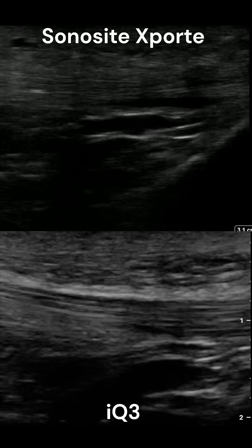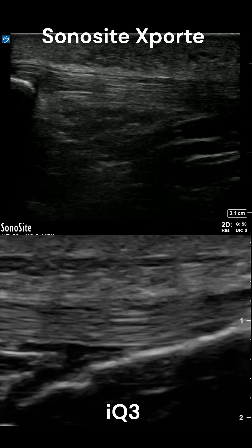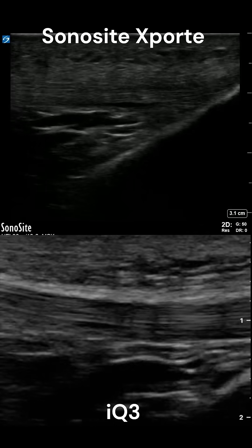Here's a patellar tendon. Both images are showing pretty fine detail of the tendon structure. If I had to choose, I would say the Sonocyte is just slightly better.